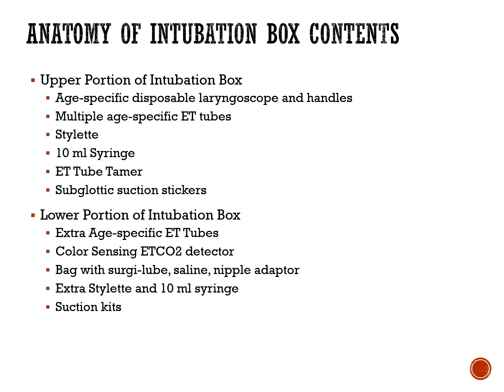So we use a lot of subglottic. I don't want to say it's the standard of care, but it's strongly recommended that they're used to reduce the chance of a ventilator-associated pneumonia. Subglottic suction tubes have a port that's connected to low-level suction, typically negative 25 to 30, in order to evacuate most of the secretions that accumulate above, or proximal to, the actual cuff.